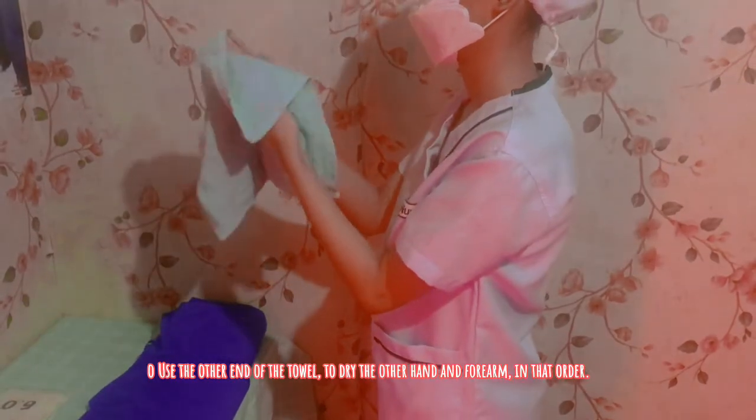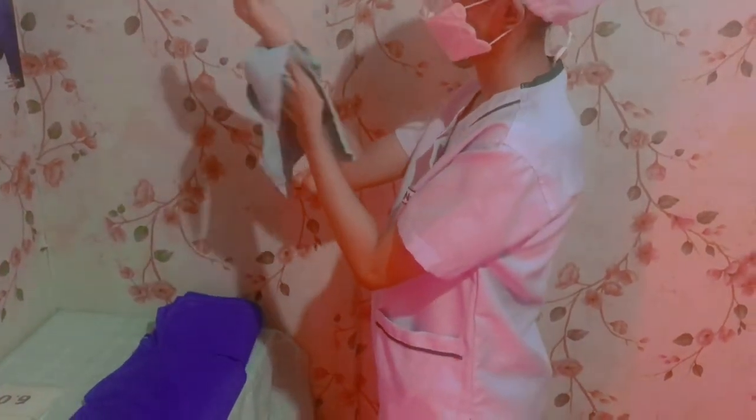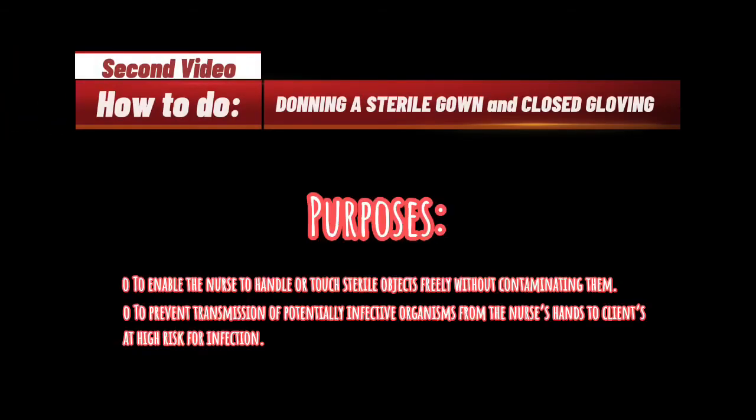could also thrive. Do not touch anything outside the sterile field to maintain the sterility of the hands or your area. Dropping the towel to the proper receptacle facilitates proper disposal and prevents spreading of unwanted contamination. The second video is about donning a sterile gown and closed gloving.